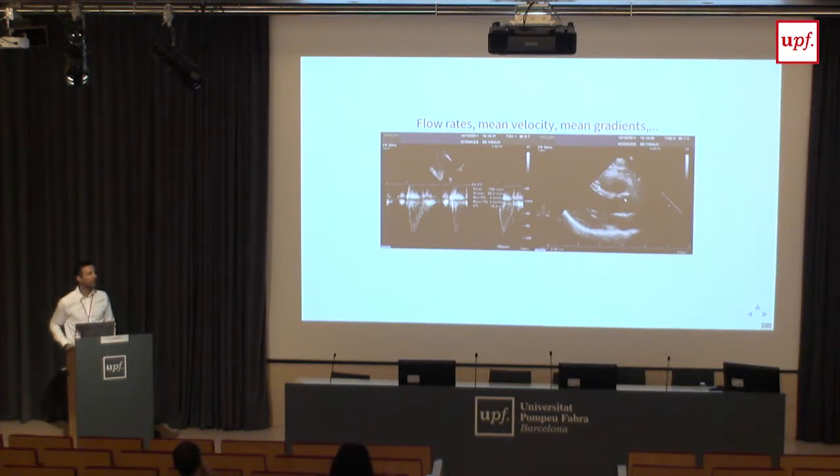So this probably covers 90%+ of all the clinical assessment that is done routinely using Doppler ultrasound. And I think this is important to know because we sometimes as engineers develop things that are rocket science, but it has to be used to be useful. If it's not used, it's quite useless. So I think the key to making something that can be used is it has to be easy to use, fast, or at least give an answer in clinically compatible times. And it has to not require an engineer to be there all the time, because then it won't be implemented widely. So that said, I'm going to talk now about things that are a bit more exciting, at least from an engineering perspective, than this.